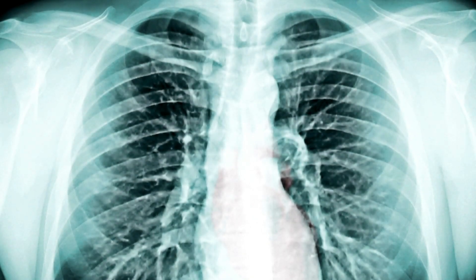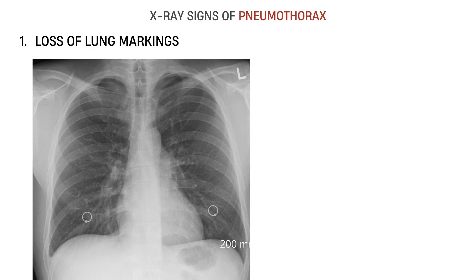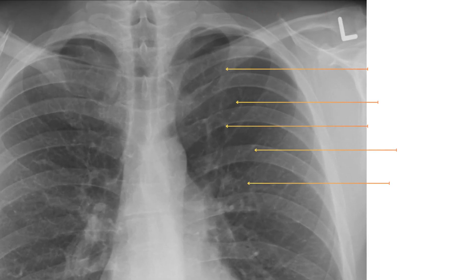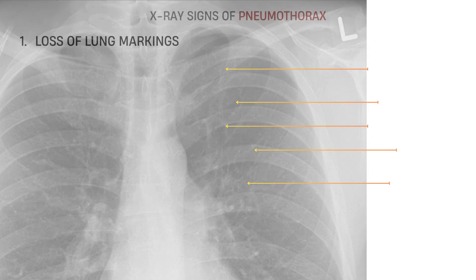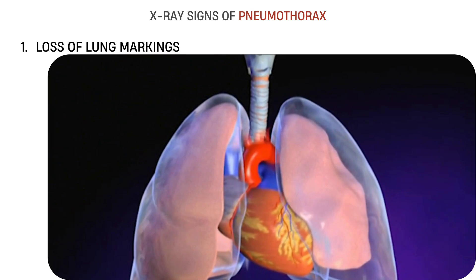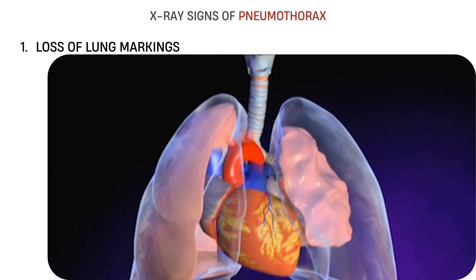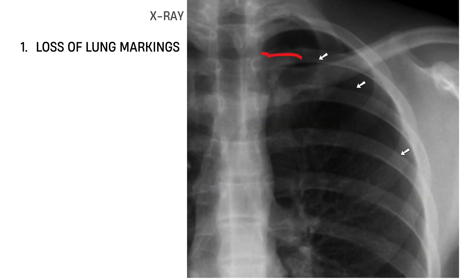Let's build up the signs one by one. First, loss of lung markings. In a normal x-ray, the lung field contains fine vascular markings that reach all the way to the edges. But when free air enters the pleural space, it separates the lung from the chest wall. This creates a region of pure air with no vessels, which appears as a dark, featureless zone. It's usually at the top or outer edges of the lung, because air rises when the patient is upright — it first collects in apical or lateral subpleural areas. That's where you check first, even in subtle cases.